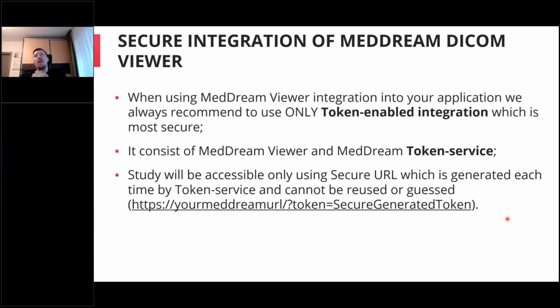And if we are talking about the integration of the MedDream Viewer, about the secure integration, the only way to have the secure integration is to use the token-enabled integration, which would consist of the MedDream Viewer itself and an additional service, which is called MedDream Token Service.